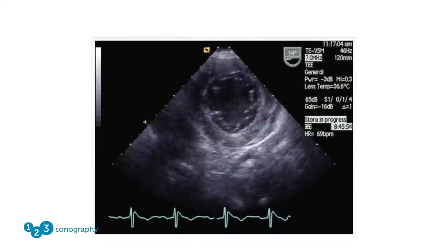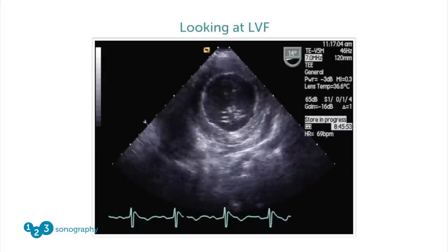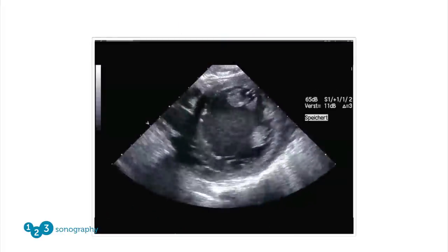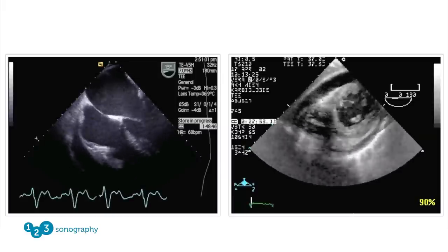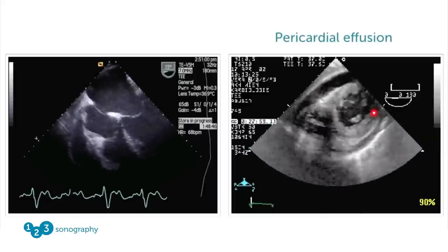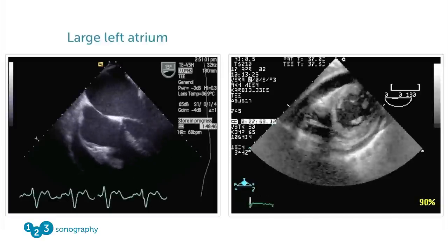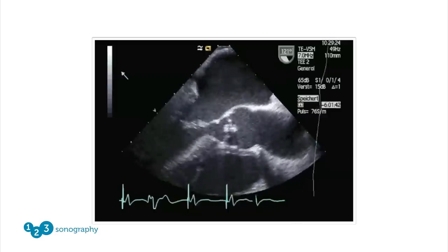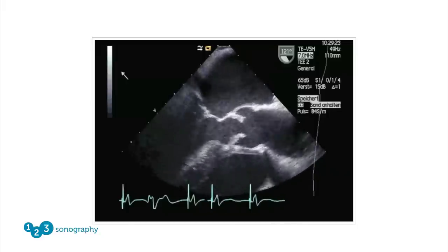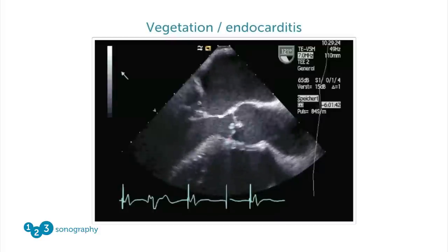Here are a few images important for anesthesiologists. This is a transgastric short axis view in which anesthesiologists assess left ventricular function — in this case, normal. This patient is not normal. Here is an example of a patient with a pericardial effusion around the heart. And here we have a patient with a rather large left atrium and poor left ventricular function — both very important issues when assessing patients post-operatively. And here is a patient on the intensive care unit who developed fever — there's a vegetation on the aortic valve: endocarditis.